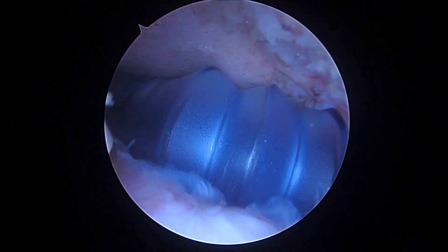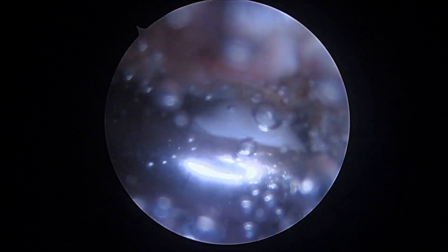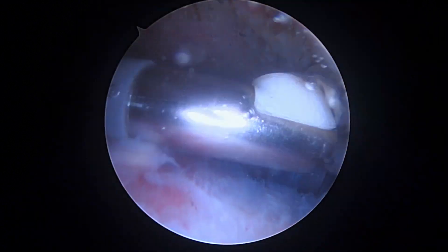So we're in the subacromial space. We've spent a fair amount of time cleaning out the space just so we can see. You had a lot of inflammatory tissue — more than just the normal healing response — and I think that's why the MRI scan was read as being abnormal and suspicious for re-tear.